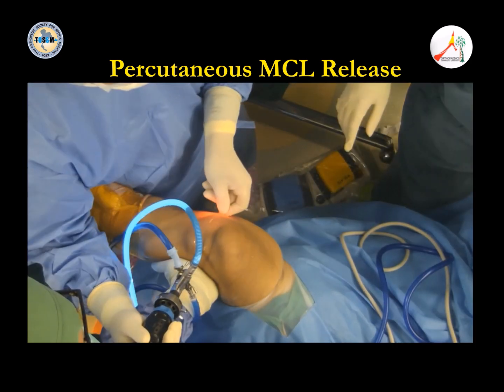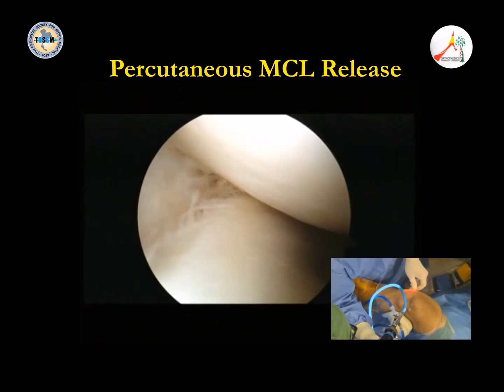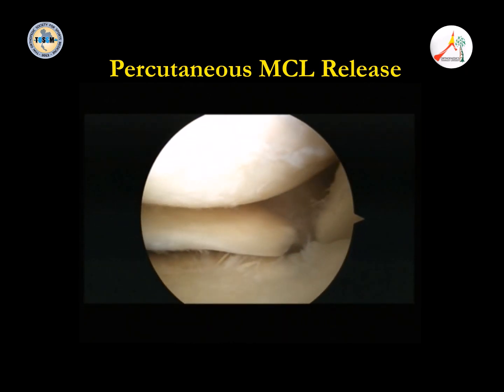And many times the joint is so tight. This is a trick we call the MCL release. You use the number 18. You see? After you just touch the posterior oblique, just posterior to the MCL, the joint will be open. And now you can do the simple repair, very simple. Your problem in meniscus repair is you do not have enough space. It's so tight. And in the past, when we tried to go in, you scratched this cartilage.